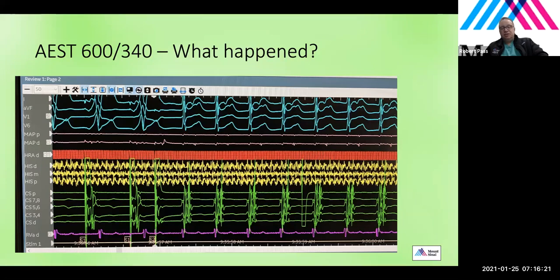That would not be consistent with high risk. It would be a low-risk pathway. And not only do we block in the pathway, but we now start having tachycardia again. So this is SVT. Notice how narrow all these QRSs are compared to the previous ones when we're atrial paced. And we again see that retrograde P wave that David was referring to before.